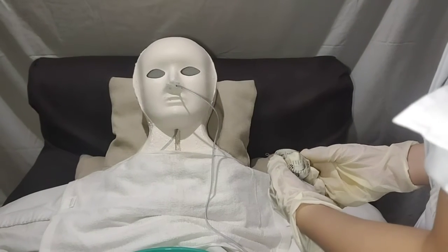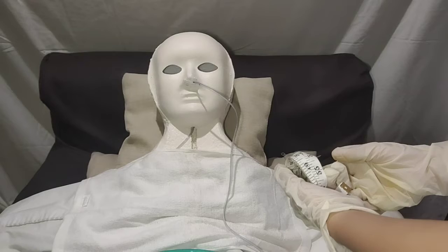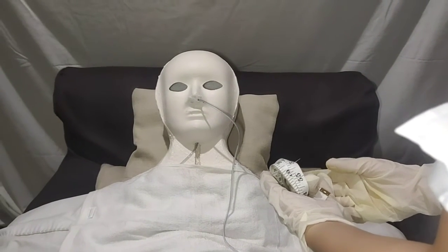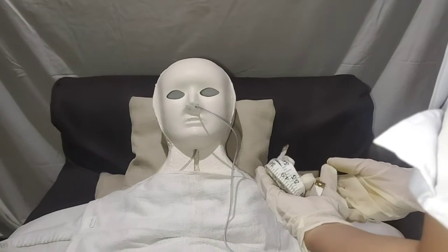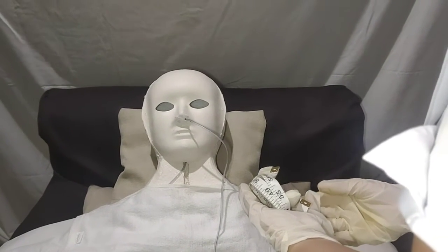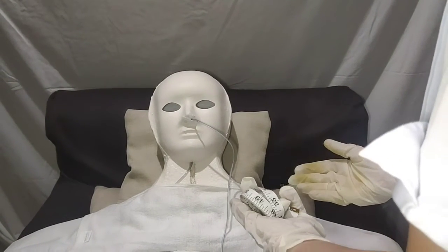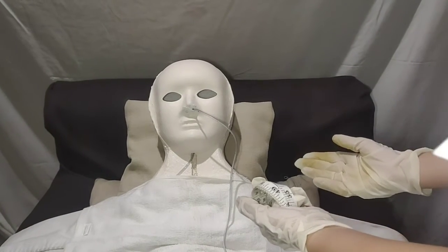Measure length of exposed tube. Reinforce marking on tube at nostril with indelible ink. Ask the patient to turn the head to the side opposite the nostril in which the tube is inserted. Secure tube to patient's gown by using rubber band or tape and safety pin. For additional support, tube can be taped on patient's cheek using a tip of paper. Ma'am, would you turn your head to the side opposite the nostril in which the tube is inserted?